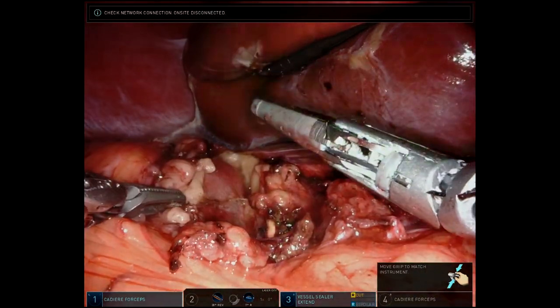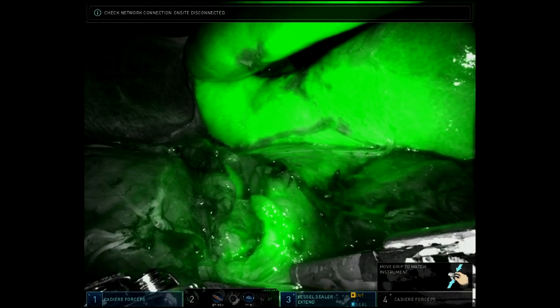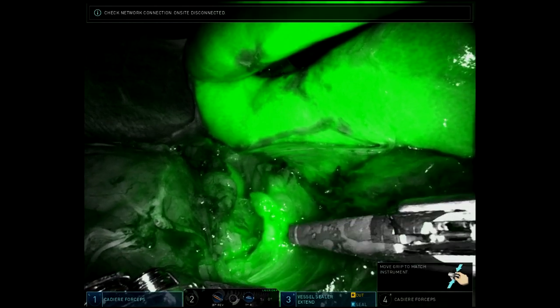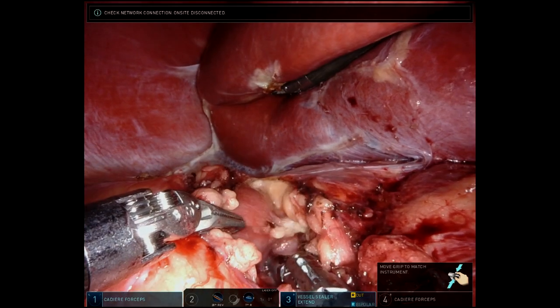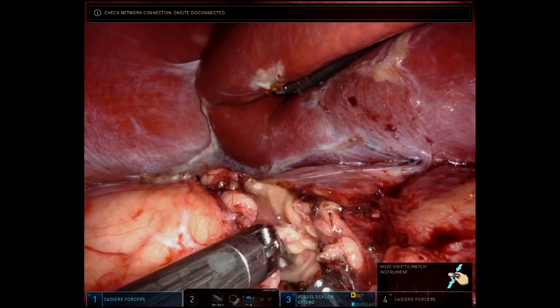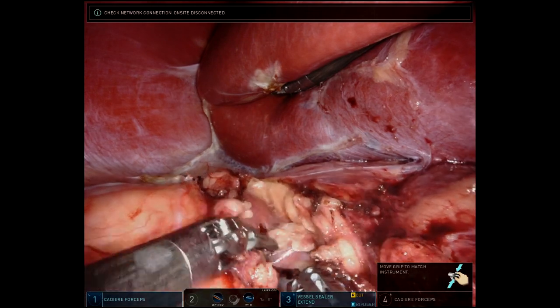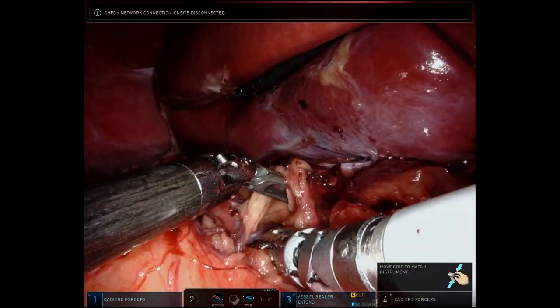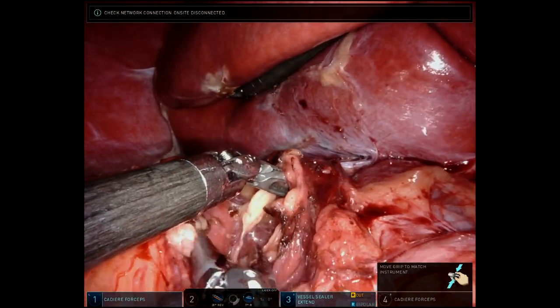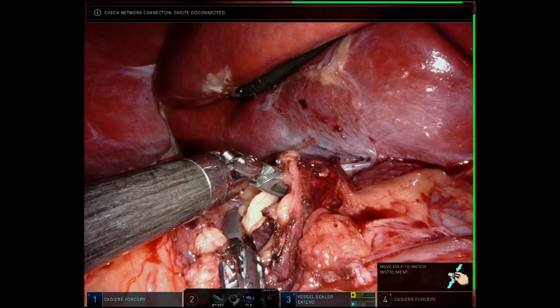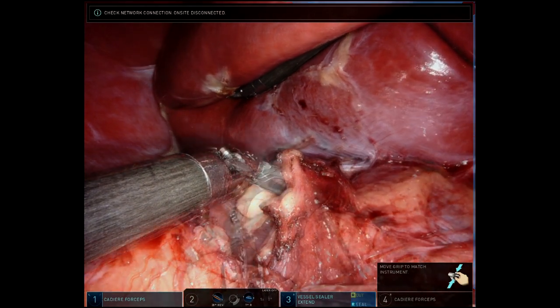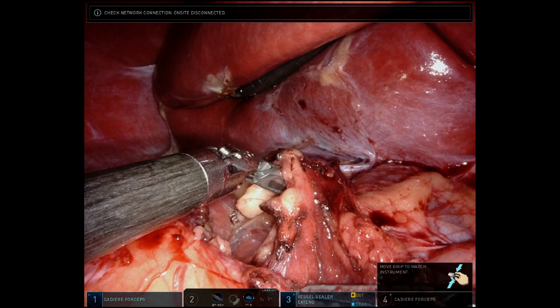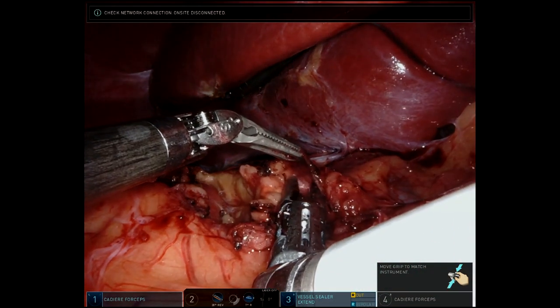Firefly is utilized for the first time at this juncture to identify the inferior border of the adrenal gland. Identifying the adrenal gland border allows the surgeon to confidently avoid dissecting into the adrenal gland, which can cause bleeding and make the dissection more difficult. Dissection then continues posterior to the gland until the psoas muscle is identified. The retroperitoneal fat is cleared from the psoas and included with the adrenal gland specimen. The left hand can then be used to retract the adrenal gland and retroperitoneal fat anteriorly, placing the retroperitoneal fat along the medial border of the adrenal gland under tension to aid in dissection.